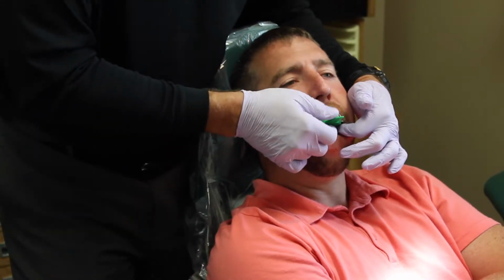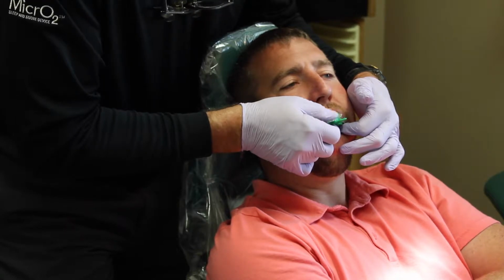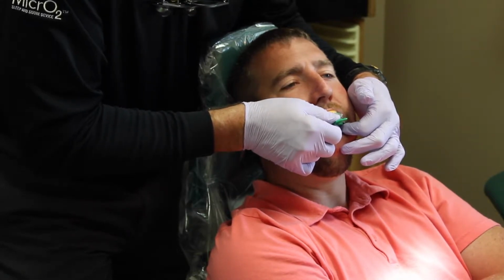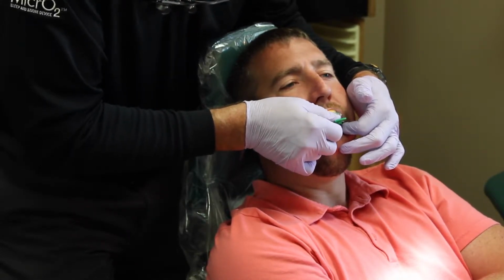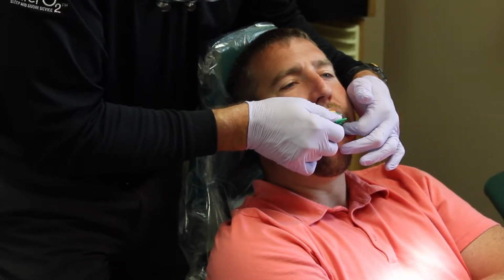Jeff, you're an excellent patient, thank you for that. This particular material is a very fast set material, so you've got between a minute and a minute and a half working time depending on temperature. And then the in-mouth set time is 2 minutes. The same is true with the light body.